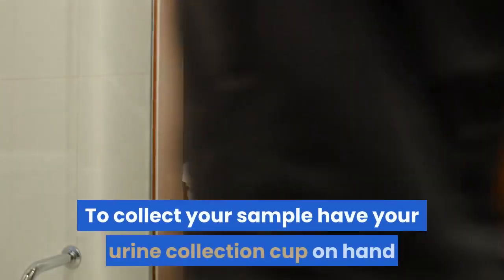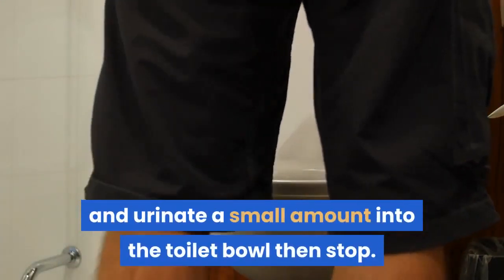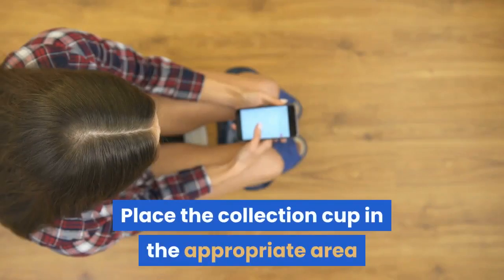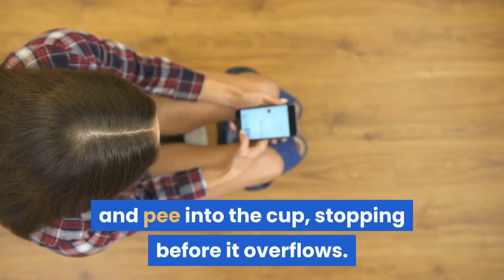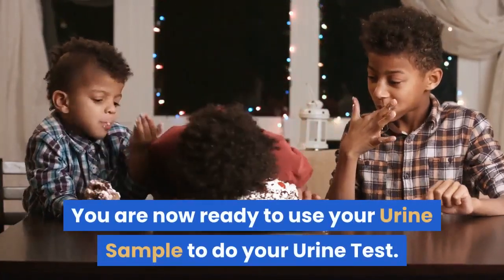To collect your sample, have your urine collection cup on hand and urinate a small amount into the toilet bowl, then stop. Place the collection cup in the appropriate area and pee into the cup, stopping before it overflows. You are now ready to use your urine sample to do your urine test.